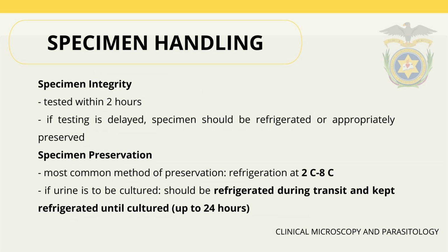For specimen handling, the integrity of the specimen should be maintained and tested within 2 hours. If the testing is delayed, specimens should be refrigerated or appropriately preserved. When preserving a specimen, the most common method is refrigeration at 2 to 8 degrees Celsius.